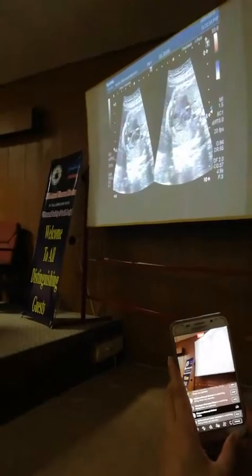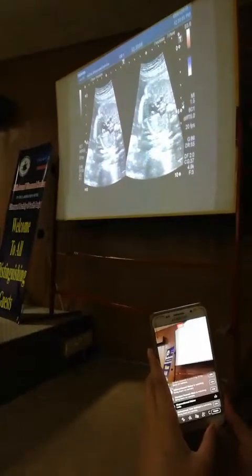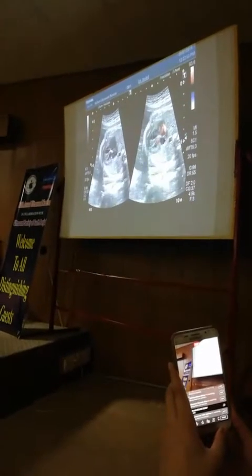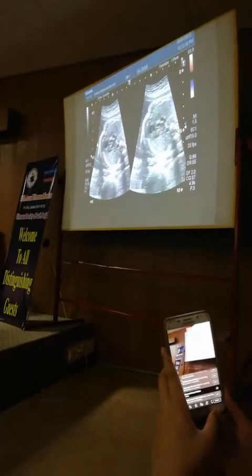पहले हमें aorta नजर आई थी, ये है aorta, ये pulmonary trunk है, और ये pulmonary trunk आगे जाके ductus में convert होगी. पहले उससे हमें नजर आया था उसकी bifurcations.